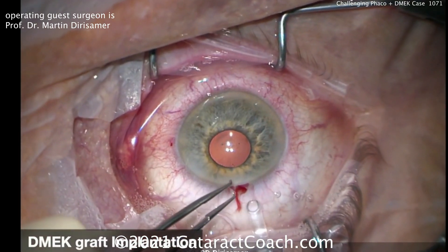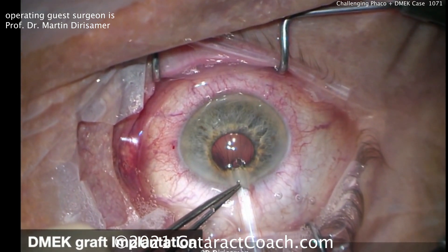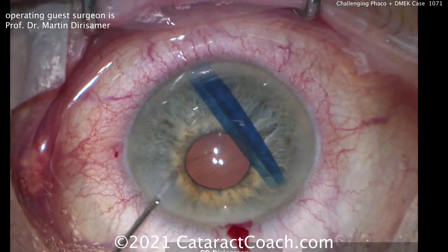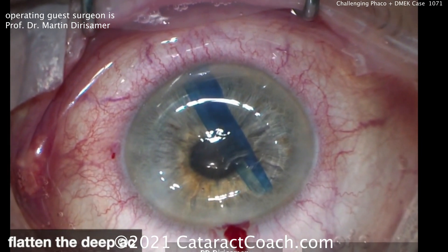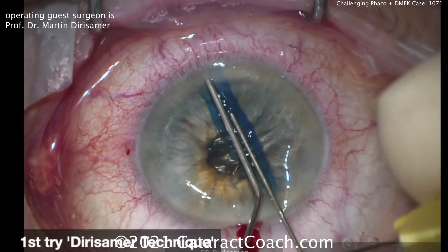Here's the graft in the injector, going to be placed inside the eye. Nice and easy. Once you get it inside the eye, close that incision and make sure you flatten the anterior chamber. You want a very flat anterior chamber — you don't want the graft to shoot out your main phaco incision.